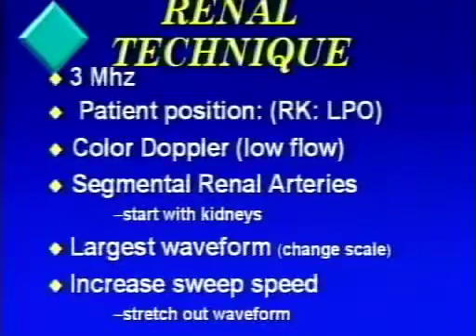We also will be adjusting changes in our sweep speed. Typically, when you turn on a machine to do a Doppler examination of the carotid, peripheral vascular, or abdominal vasculature, the sweep speed of your spectral Doppler will default to about 4 cycles per second. What we'll want to do in the renal indirect method of the renal arteries is to increase that sweep speed a little bit faster, so we might only see 2 cycles per second.